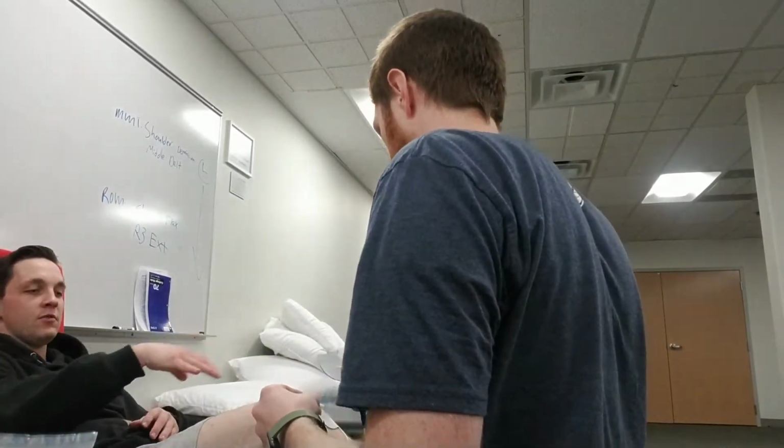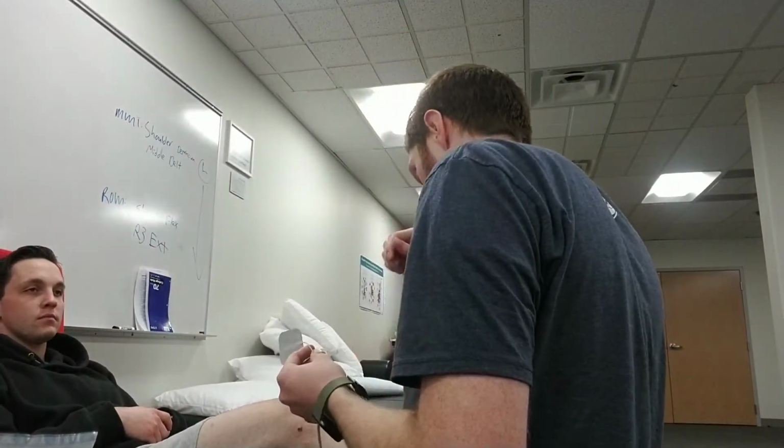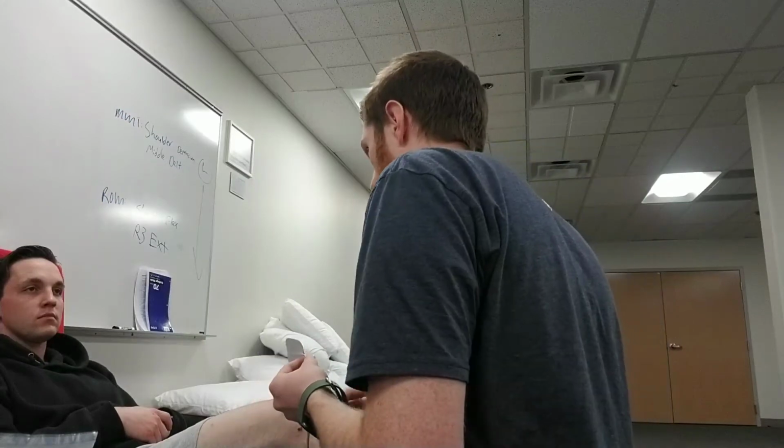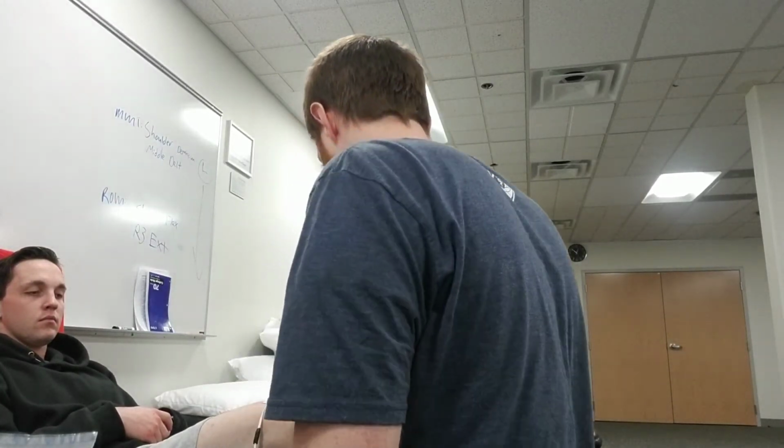Just kind of like a general throbbing, I would say, through the whole thing. Okay. If it is more on one side or another, just let me know and I can move the pads so that they focus more on that area. Okay. But today we'll just go through the whole thing. Okay, comfortable there? Mm-hmm.